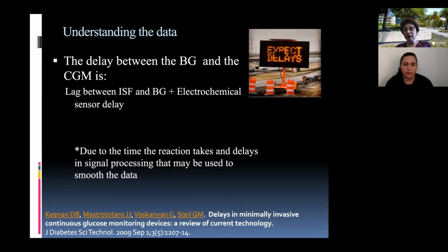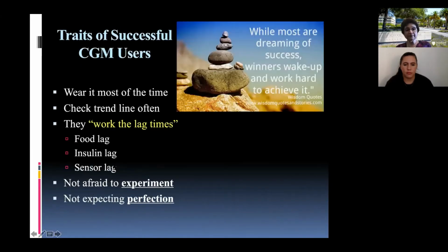If you feel better but the CGM is still showing low, obviously you feel nervous. You think, I'm eating and I feel better, but my blood sugar is still low on the CGM, and you keep eating more. That leads to overcorrection. So again, remember the 10 to 15 minute delay.